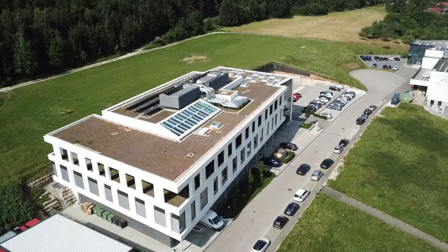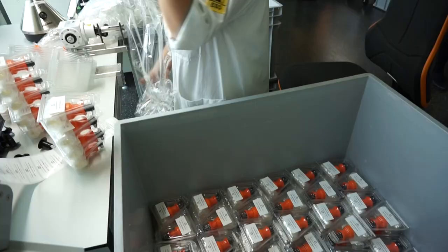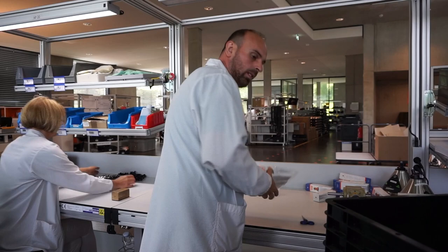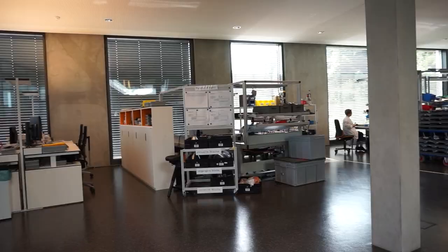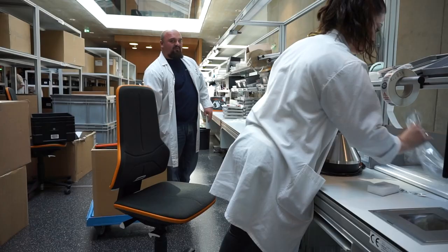I welcome everybody to our new factory here in Tuttlingen. We built this factory because the demand for our vaporizers was so high, we had no other choice. It was not possible to rent a factory like this in Tuttlingen, so we decided to build one. As we knew it would be the first factory for medical cannabis inhalers worldwide, we said we don't want to only build a tin box on a concrete socket, but we want to make something beautiful, something the cannabis community can be proud of.